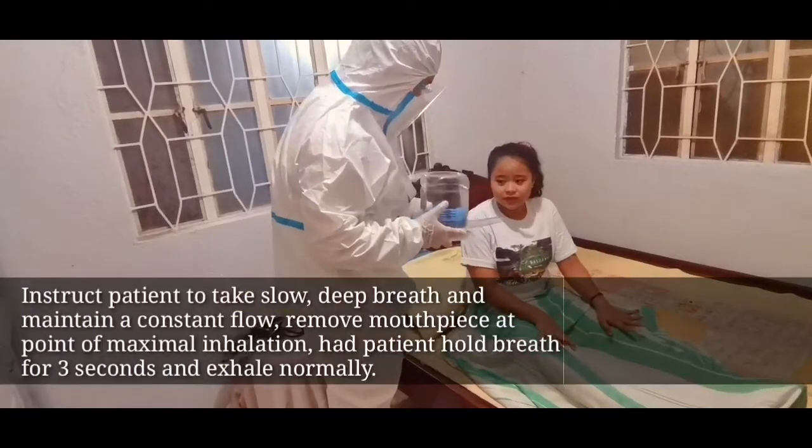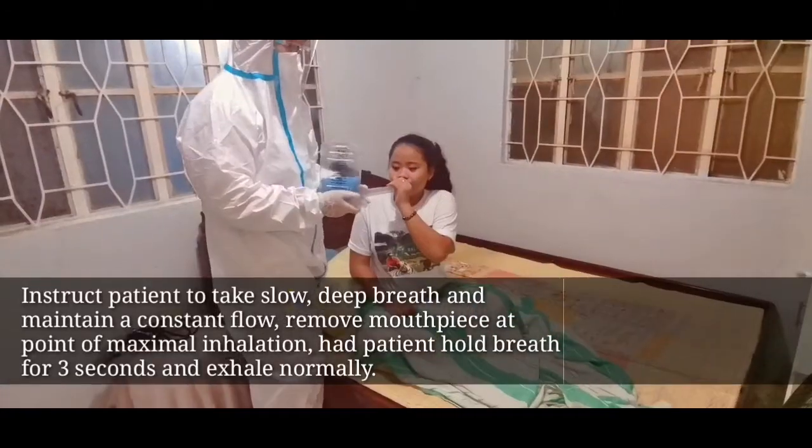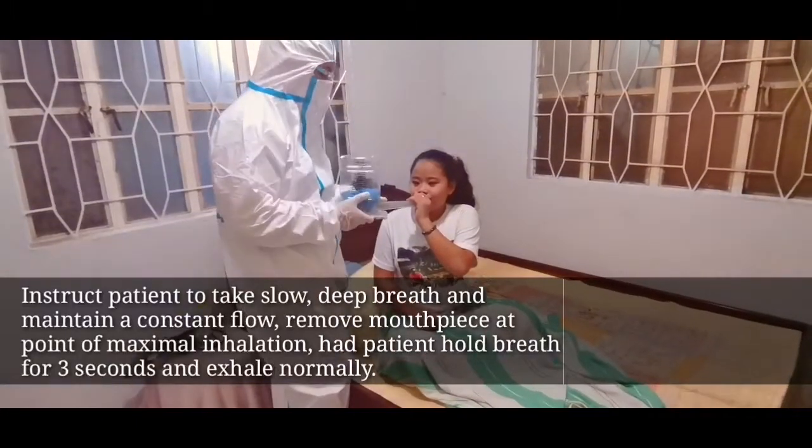Instruct the patient to take slow, deep breaths and maintain constant flow. Remove the mouthpiece at the point of maximal inhalation, have the patient hold breath for 3 seconds, and exhale normally.